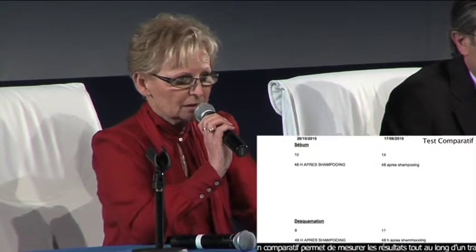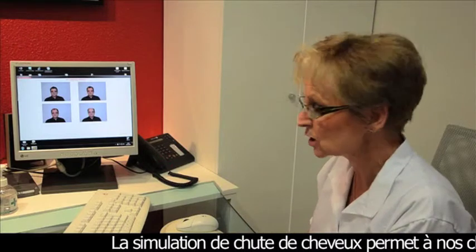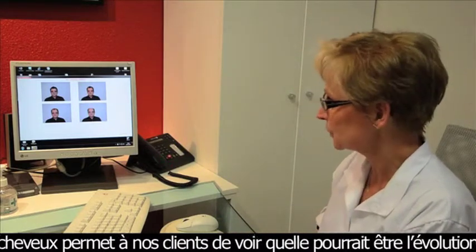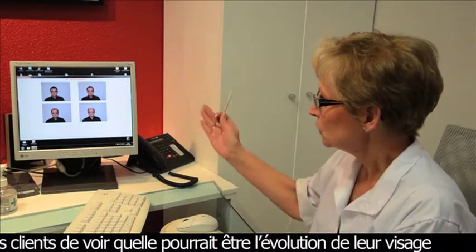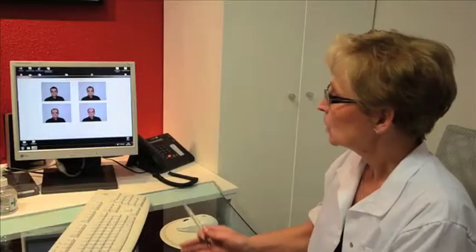Here we have the densitometry and the capilloscopy with the different dates, the sebum tests, the desquamation tests as well, the comparative test, as I was saying, for the trichogram earlier. And here we come back to the hair loss simulation so that the client can understand what their face will look like if they do not act and if they become gradually bald. It's never nice to not recognize one's own face.